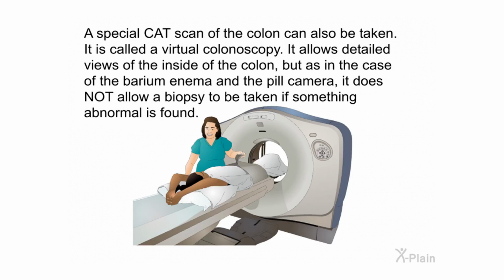A special CAT scan of the colon can also be taken. It is called a virtual colonoscopy. It allows detailed views of the inside of the colon, but as in the case of the barium enema and the pill camera, it does not allow a biopsy to be taken if something abnormal is found.